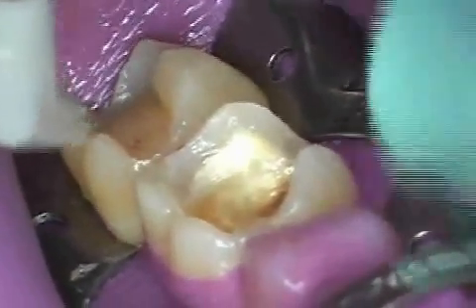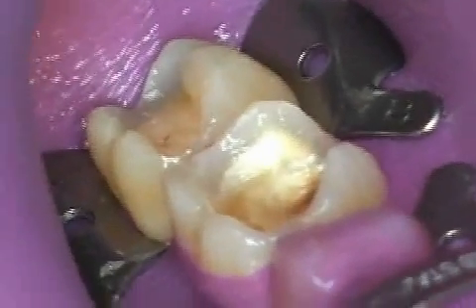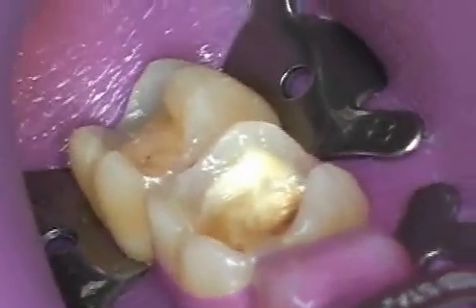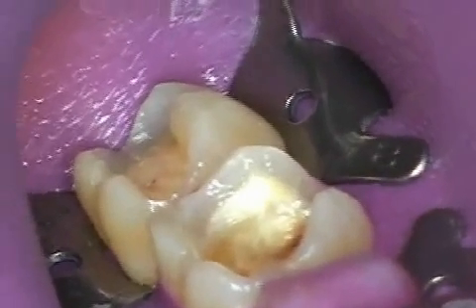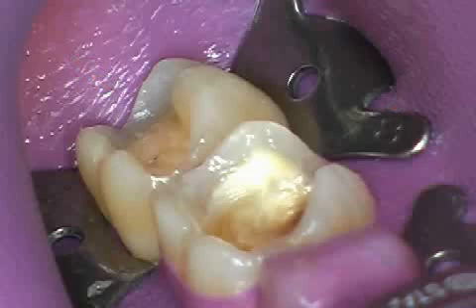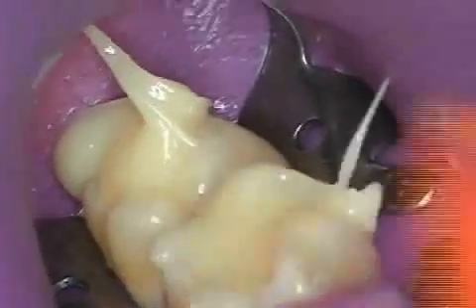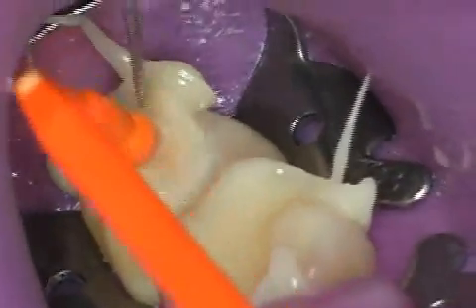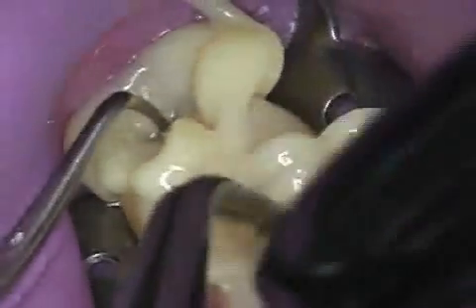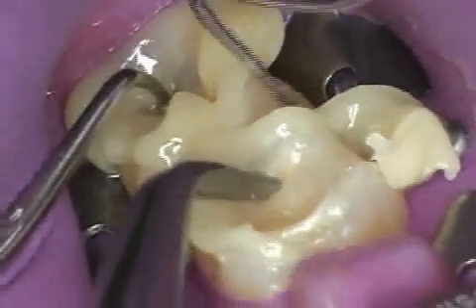You see two teeth that have been prepared for ceramic inlays. The ceramic inlays are supposed to be put in place, so the work area has been dried using a rubber dam — the violet membrane. The tooth has been cleaned and conditioned with various substances. Now the glue is applied and the ceramic inlays are positioned.